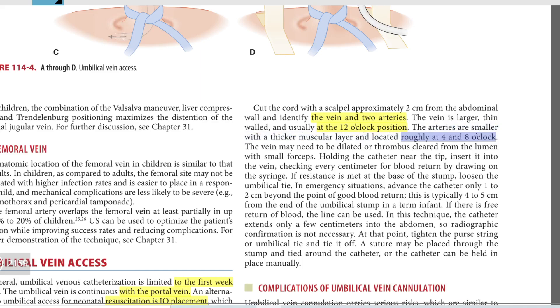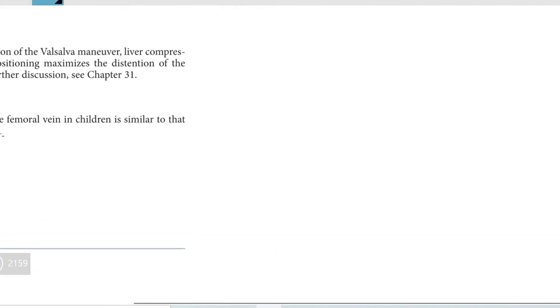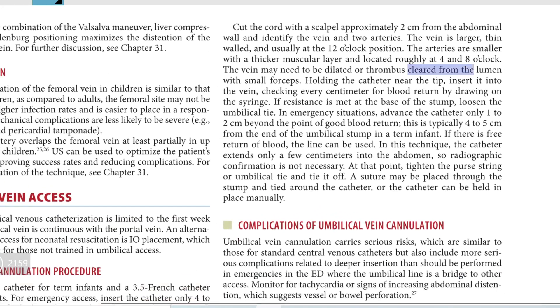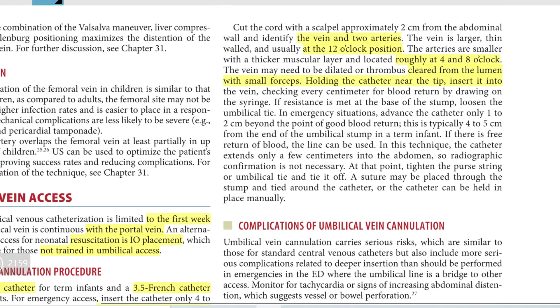The vein may need to be dilated or cleared of thrombus from the lumen with a small forceps. Holding the catheter near the tip, insert it into the vein, checking every centimeter for blood return by drawing back on the syringe. If resistance is met at the base of the stump, loosen the umbilical tie.